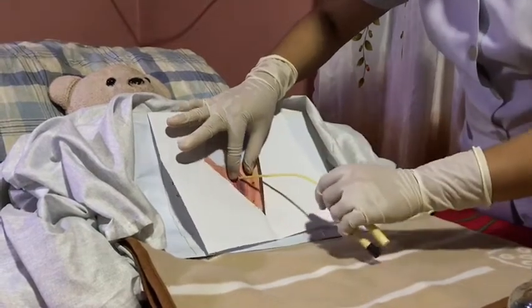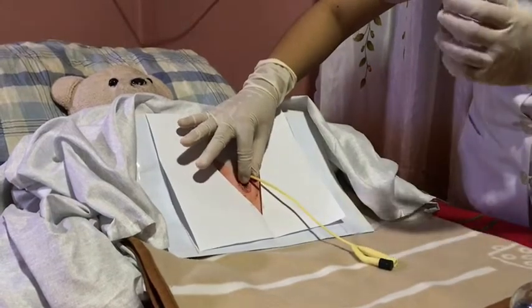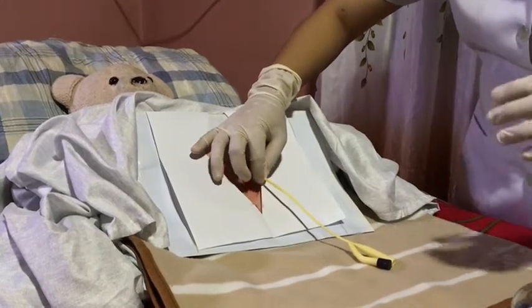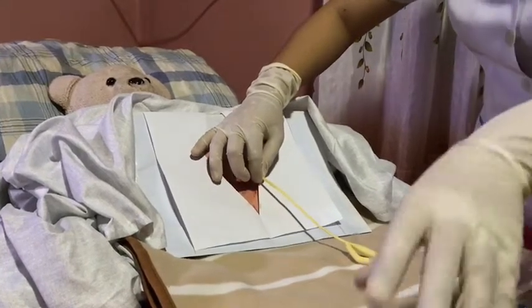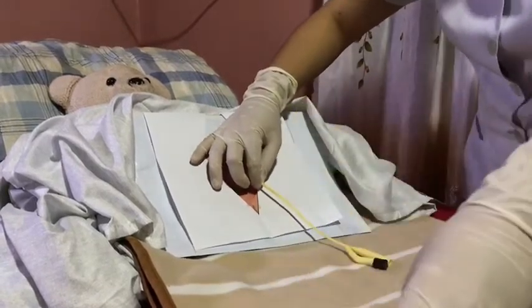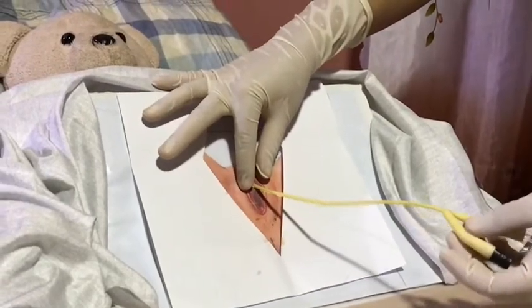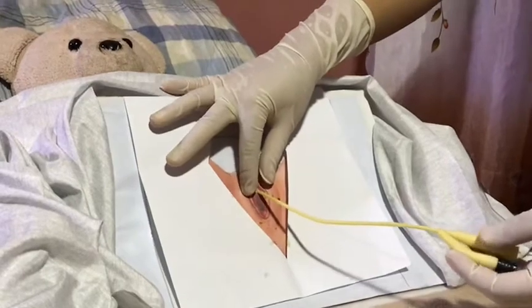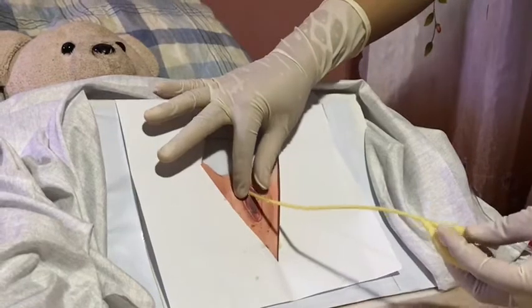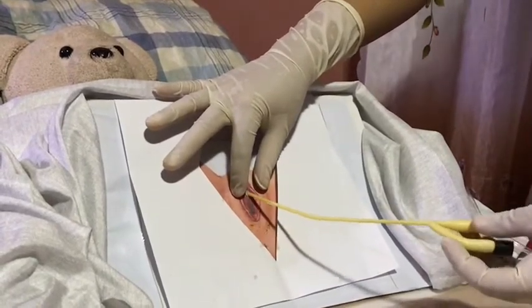Okay, right. And now, if a specimen needs to be collected, pinch the catheter with the thumb and the finger while placing the specimen in a container. Rest the hand on the pubis area while holding the catheter in place to prevent the pulling and pushing of the catheter. This is done to avoid the infection of the urethra.